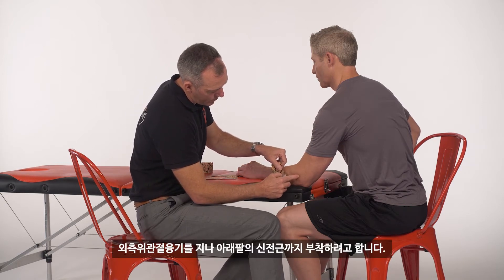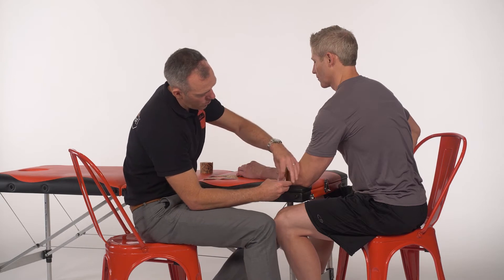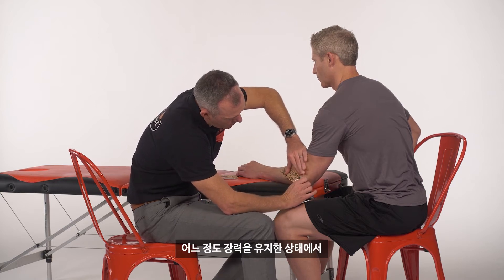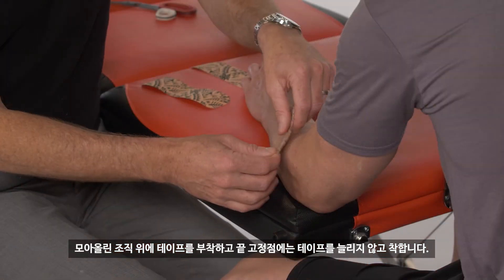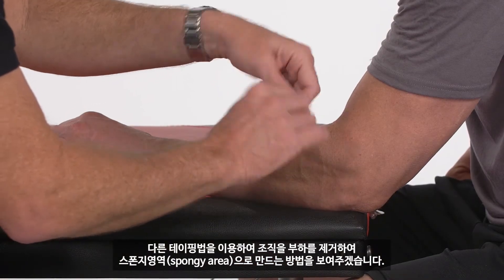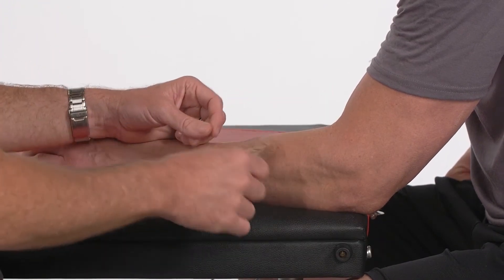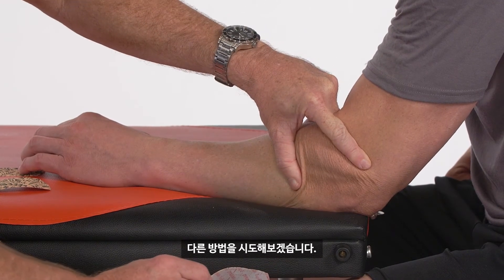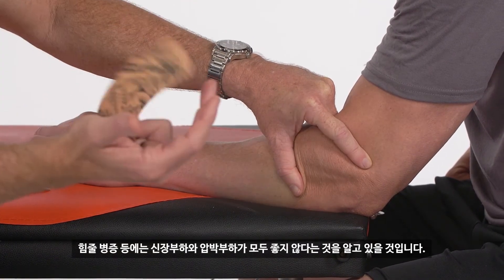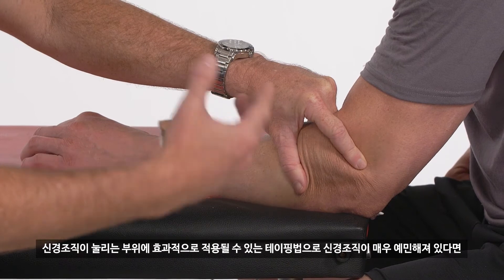So say we're going to box up around this forearm, around the extensors and onto that lateral epicondyle. We anchor with our thumb, pull all of that soft tissue together, and get our tension on. While we hold that we sweep through, and then our other anchor point has no tension. Even with that one piece we can see how we start to get this soft spongy area that starts to bunch up, giving us this orange peel type of effect. This can be useful for our tendinopathies, which don't like that combination of tensile load and compressive load, so this can perhaps affect that compressive load.